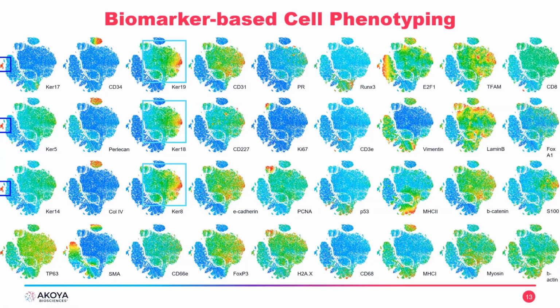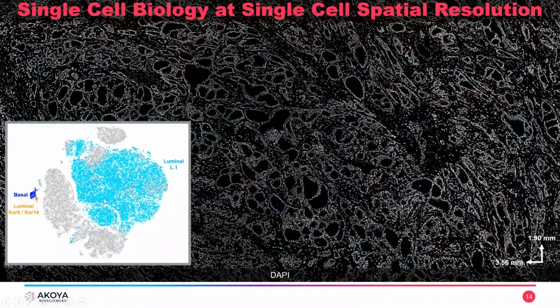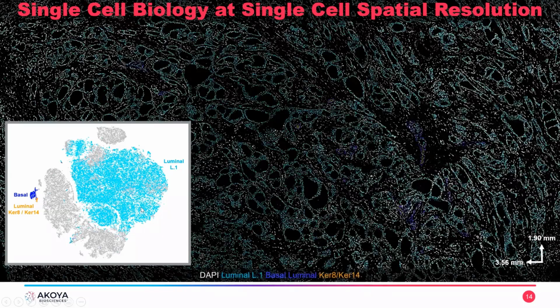So we're going to look at these data now, and we're going to see how these epithelia differ. What I would like to show you are actually clustered results from 3 different cell types. Now, this is the same T-SNE plot that I've used all along, but I've grayed out the areas that we're not going to speak about in favor of the 3 different epithelia that we will speak about. Now, the first 2 are probably the most obvious ones. Those are your luminal epithelia.